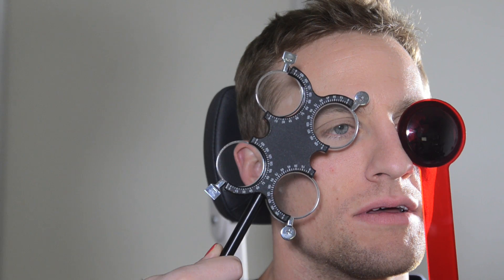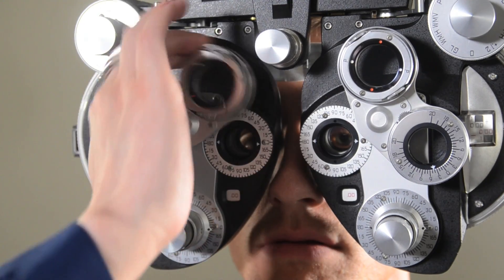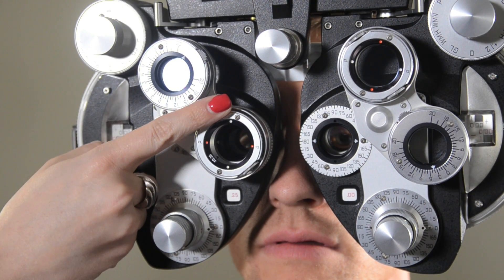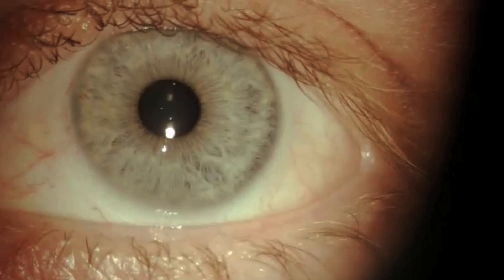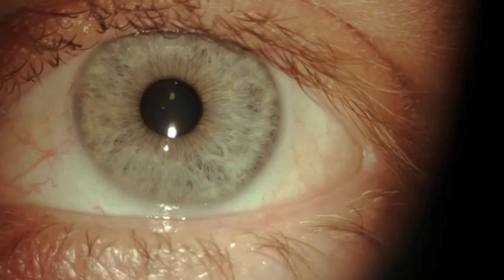For spherical lenses, I generally do an out-of-phoropter spherical over-refraction. I always start with a plus-50 lens flipper or loose lens in front of the patient — it's the number one easiest way to tell if the patient's been accidentally over-minused. I try not to give more minus unless the patient's acuity improves with it. If they have decreased acuity and a spherical over-refraction, then check the cylinder behind the phoropter. Before you can actually prescribe the lens to the patient, you need to assess it under the slit lamp to make sure it's a good fit.